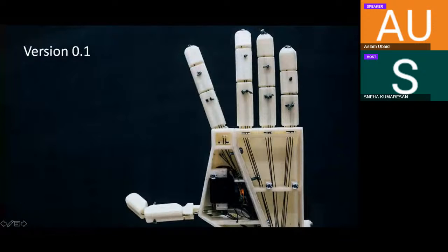So I was saying that these were one of the initial designs that we came up with, and we happen to present it at many places. But as you can see, this is a flimsy design by itself. This was a 3D printed design that we made in our Fab Lab, and what happened was the device would malfunction, or it would fail at certain points, which were unpredictable by itself. And the overall movement that we tried to augment was not achieved by this.